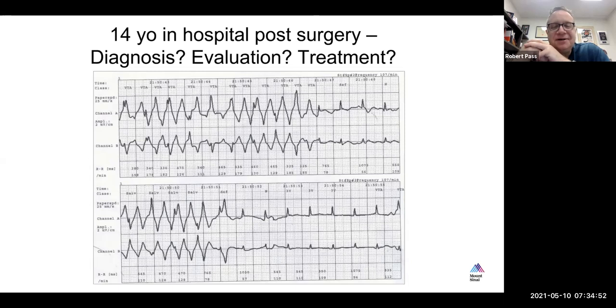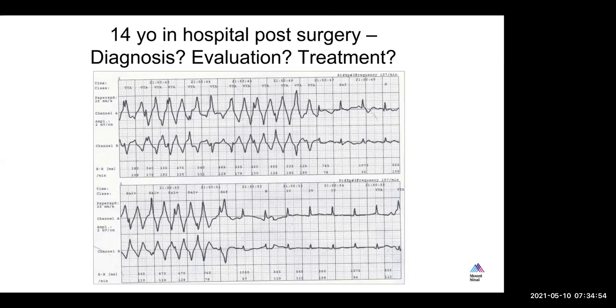Are you sure this is an arrhythmia, doctor? So I'm not sure. I'm seeing this defined. Even when I look before each widened QRS, I still see there seems to be some sort of deflection and it's sort of consistent. So I'm not very sure.